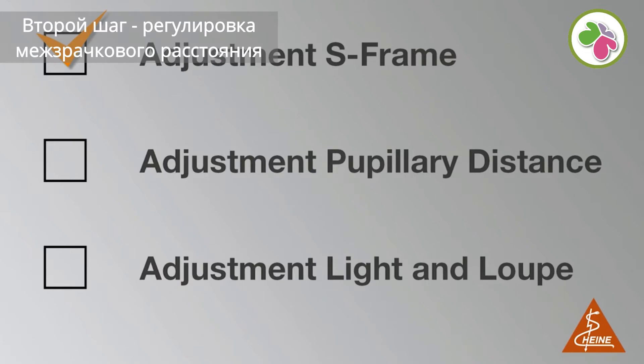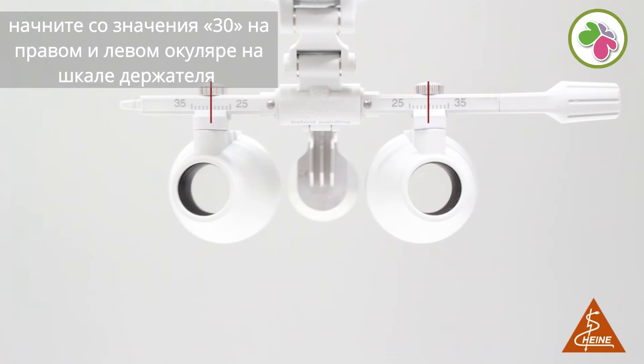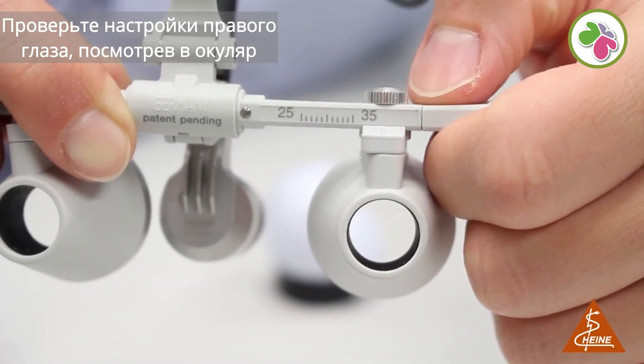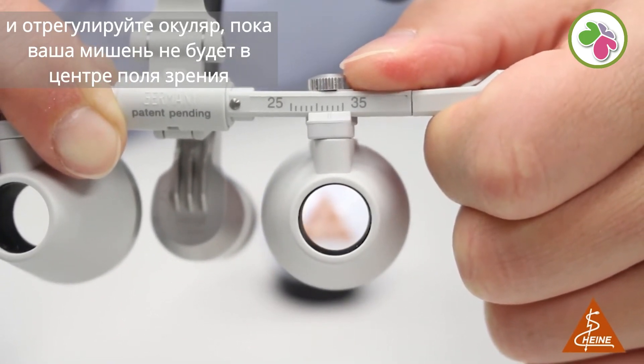Step two: adjustment of the pupillary distance. Position a target at the required working distance. To find your individual pupillary distance, start with the value 30 for the right and left ocular on the scale of the iView loop carrier. Check the settings of your right eye by looking through the ocular and adjust the ocular until your target is in the center of your field of view.